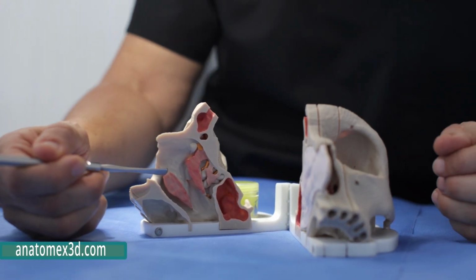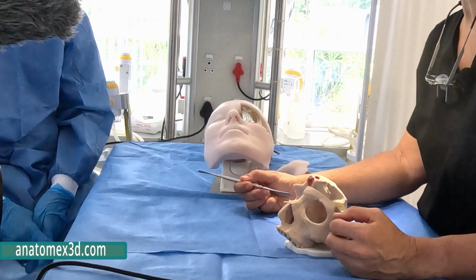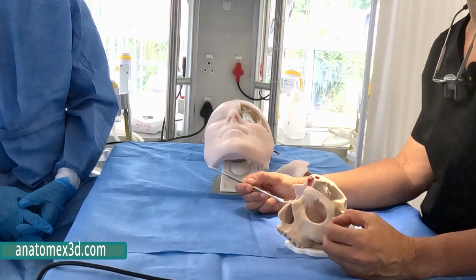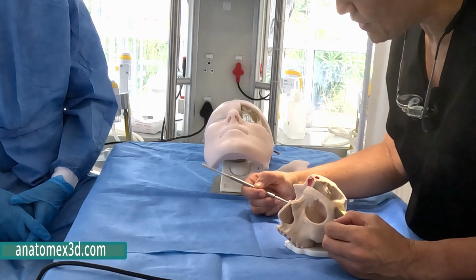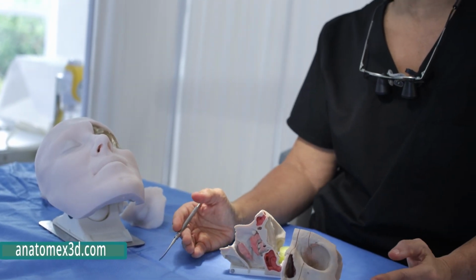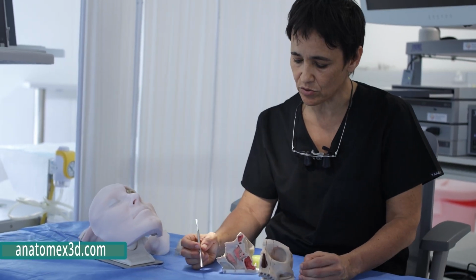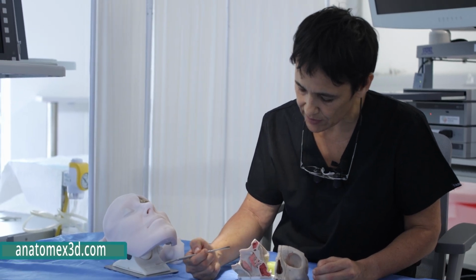If you use an oxymetazoline spray, it shrinks this turbinate, and that's why people can breathe better. This structure we sometimes make a little bit smaller with something we call a turbinoplasty. We don't do a turbinectomy, which would mean taking the whole structure away, because then your nose will be too open and it will cause drying and crusting. The middle turbinate is a very important landmark to the nose and to the sinuses, and it guides us to all the different sinuses.